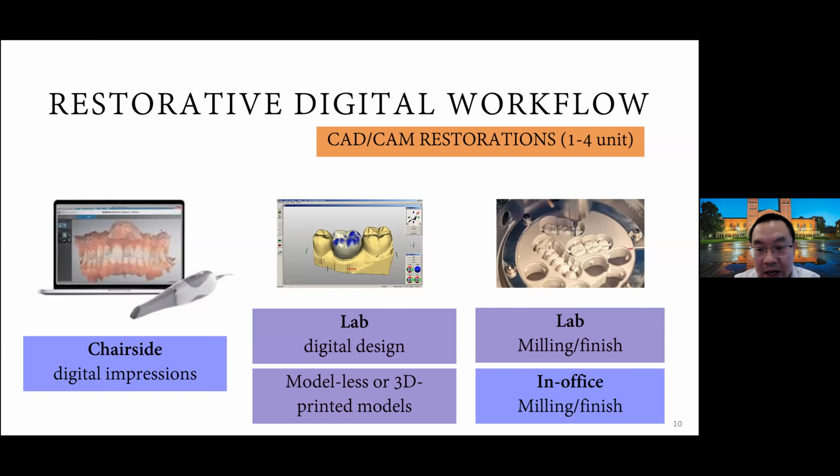And then you can also have an oven in your own in-house lab, and then basically bake, sinter, crystallize and glaze this in your own office if you're doing same day delivery. That's why I was thinking about talking about how you have to choose your right applications. Not everybody is going to go for same day delivery as a novelty, right? If you have a large scale practice that has a lot of patient demand for single day delivery, then you will figure out soon enough that maybe it's time to invest in a mill in your office and start adopting that workflow.